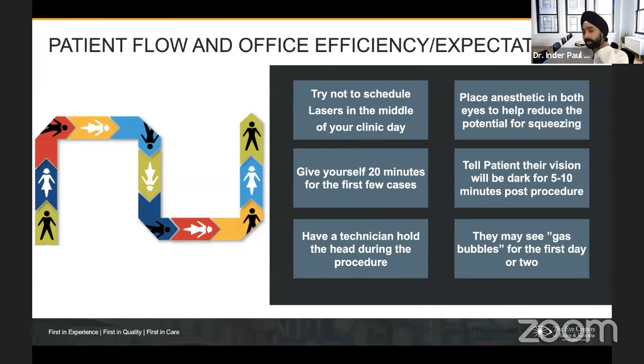Dr. Biswas, how about you? What do you utilize? I always use one shot, 1 pulse per shot. That gives me a sense of better control in my hands. Yeah, I agree. It's very much more control for me as well.